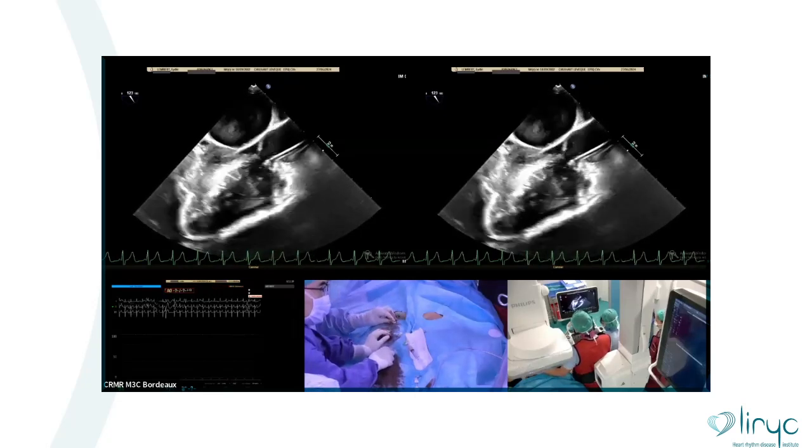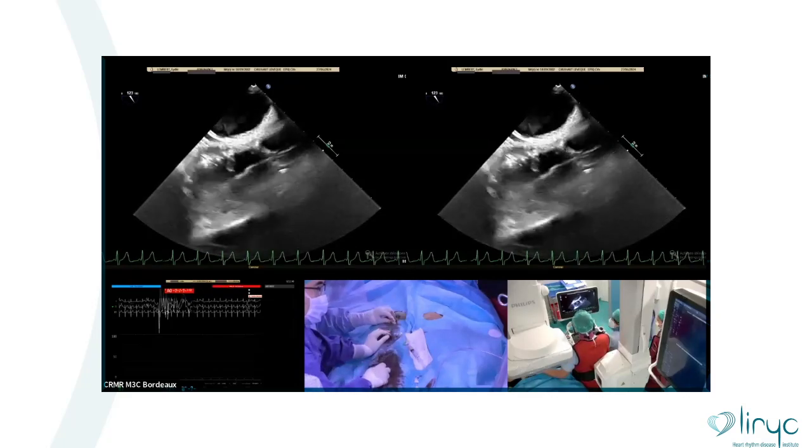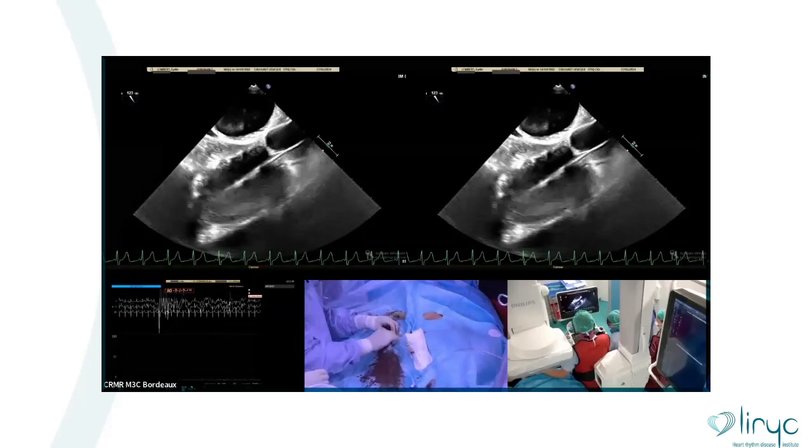Okay. Well, I think we're fine. Okay, it's fine. So now we pull back one wire. Good job.